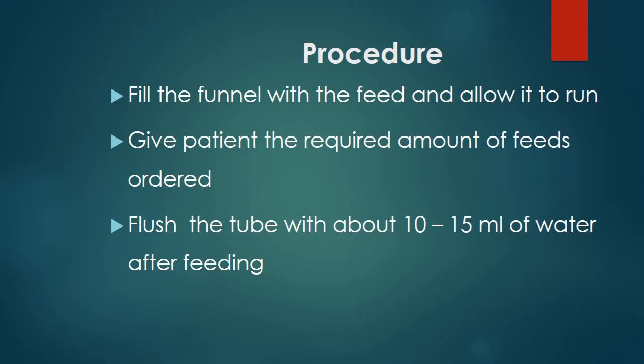However, in most deprived hospitals, they do not have the resources to do that. They lack the materials because you need a feeding bag, you need a funnel, you need other things which are not usually there. So because of that, people mostly resort to the bolus or the push method. But where the facilities and resources are available, it is recommended that we resort to gravitational feeding rather than the bolus.